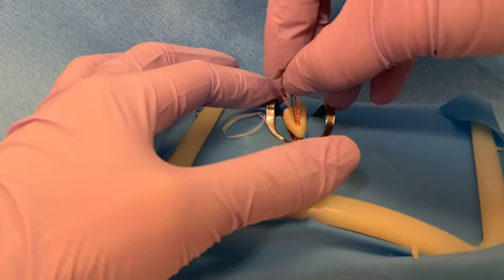There was still some gutta percha above the level of the orifice, so we heated up the endo plugger again and scraped it all out. Once the gutta percha has cooled, it transforms back to its unheated beta state, which is solid and compactable. Now we can condense or down pack the gutta percha with the unheated endo plugger until it is flat and level with the orifice. Any excess gutta percha that remains on the walls can be removed with either a spoon excavator or an explorer. At the end of this step, the entire pulp chamber should be clean. Do not place any restorative material.